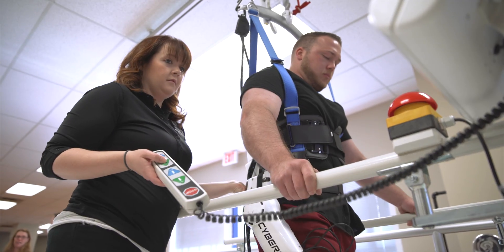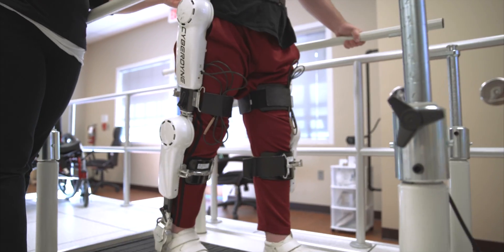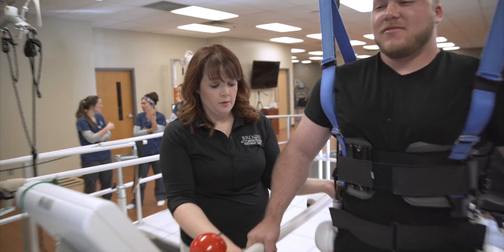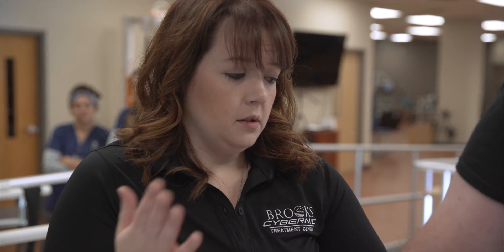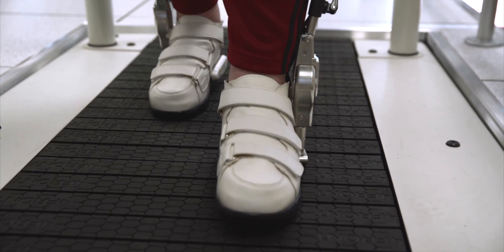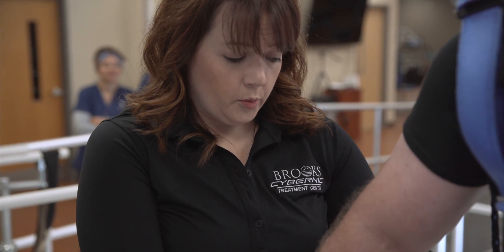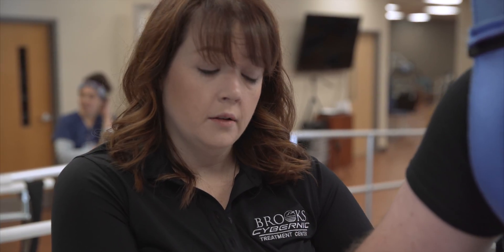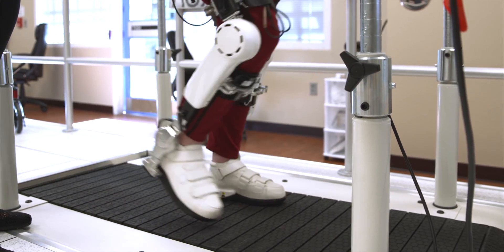We're going to get the treadmill started. Right now we're in walk mode, so the robot is still reading Maverick's signals to initiate the movements, but it's going in a pattern to also help swing and get the legs moving in a natural walking pattern. Based off of his signals right now, we have Maverick's hips in what's called CVC — cybernetic voluntary control — which is the main thing with HAL that we're really working on. And then his knees are in CAC, cybernetic automatic control.